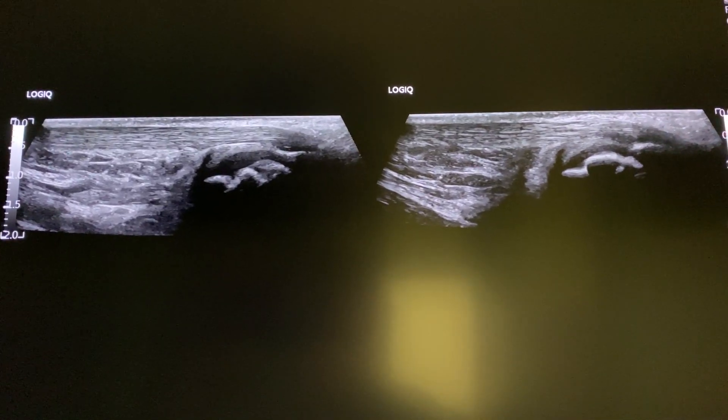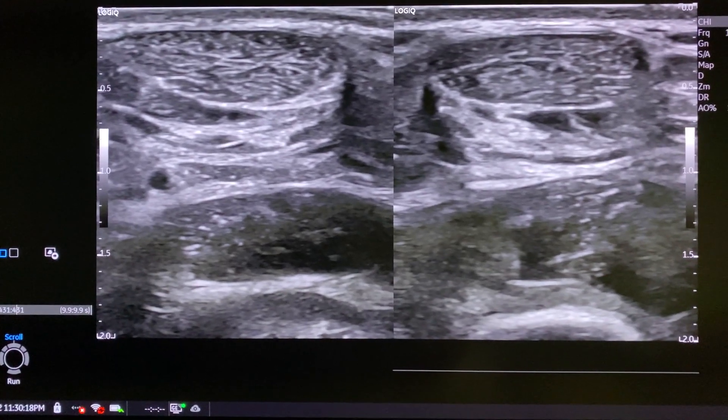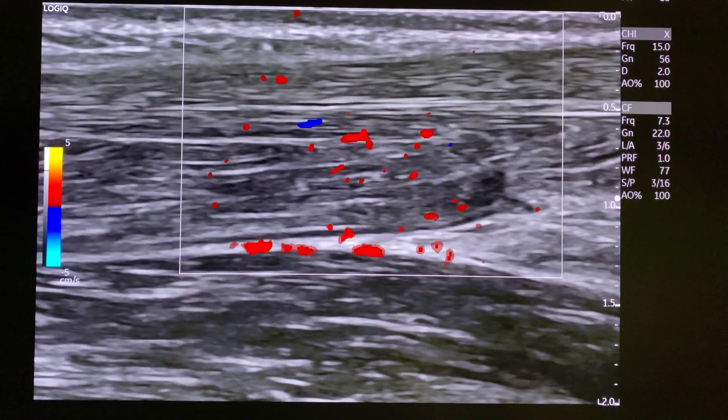I do a side-by-side comparison in sagittal, checking for symmetry or asymmetry, and also a side-by-side comparison in transverse. As always, put color Doppler on and look for hyperemia, which can be a sign of inflammation.